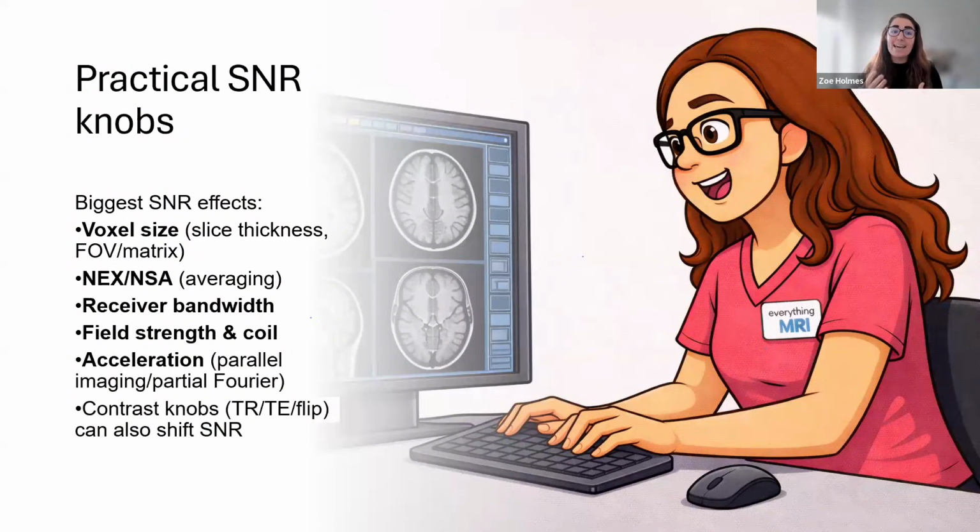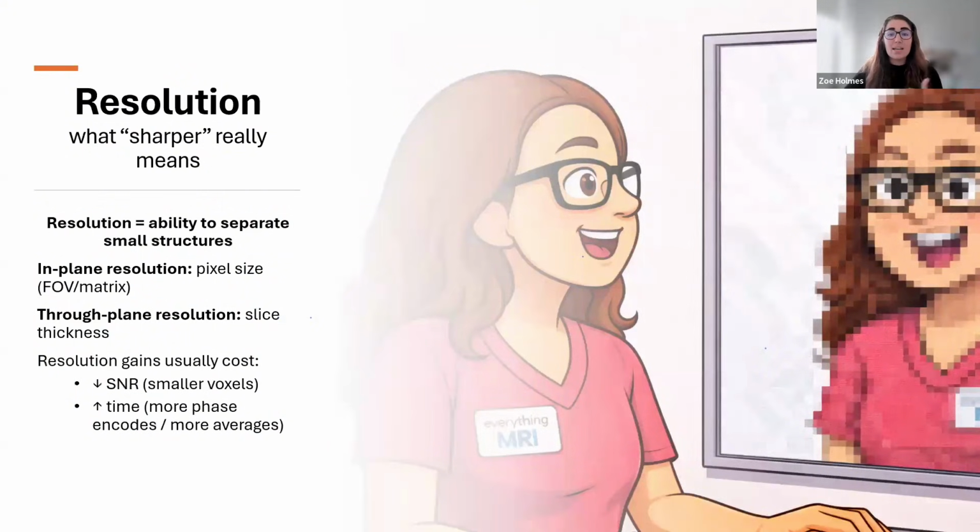This will avoid you making accidental non-diagnostic outcomes that's going to tax you for the sequence that didn't end up working. So do one knob at a time, one fix at a time, and that'll help you immensely in building your intuition as you grow in this modality.